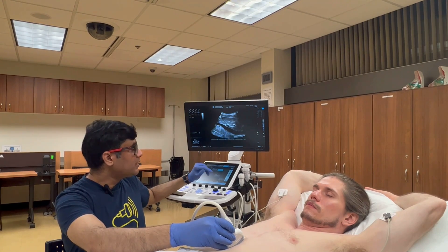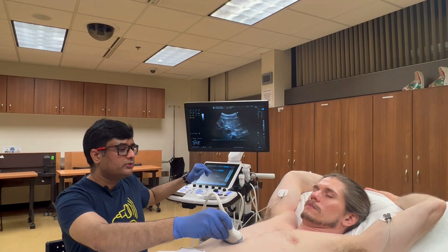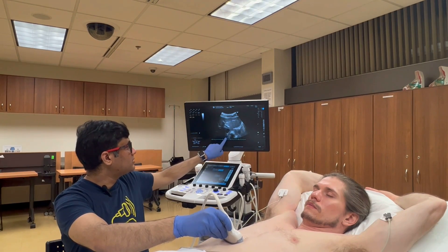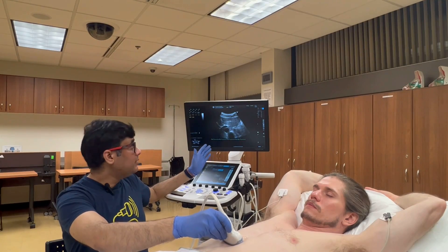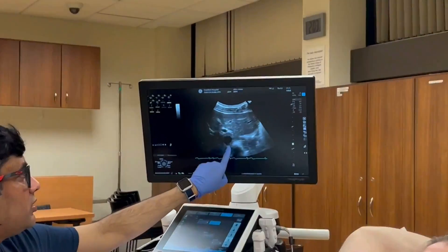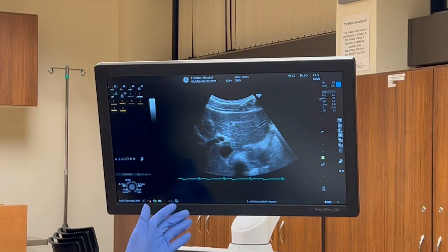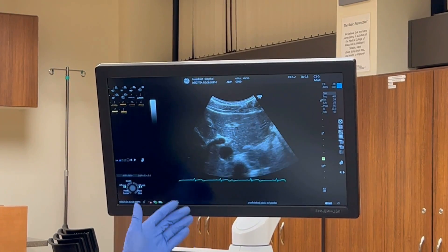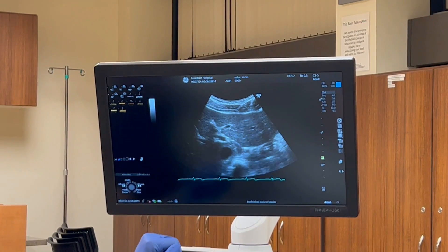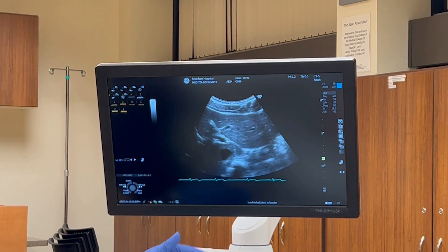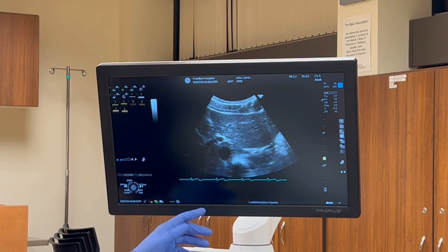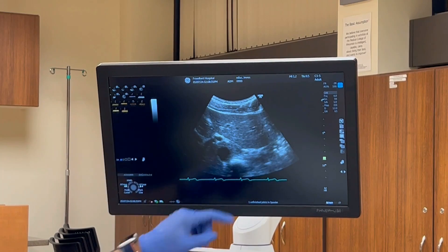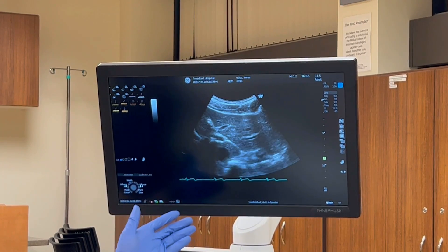Once you find the IVC, rotate the transducer 90 degrees to find the vessel in its short axis. By measuring the anteroposterior diameter in the short axis, you get a sense of whether you're falling prey to the cylinder effect in long axis or not. Sometimes the vessel might appear plethoric in long axis, but when you look at it in the short axis, it's more or less oval and might not be really plethoric.